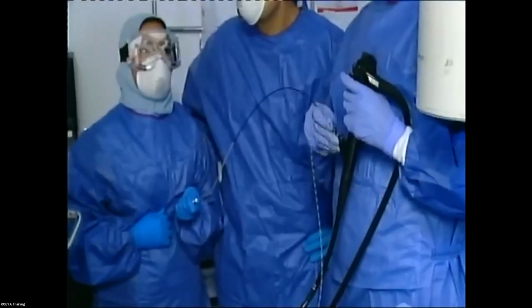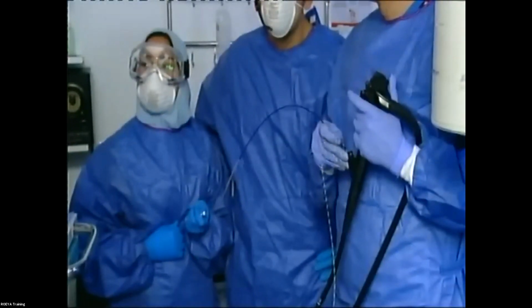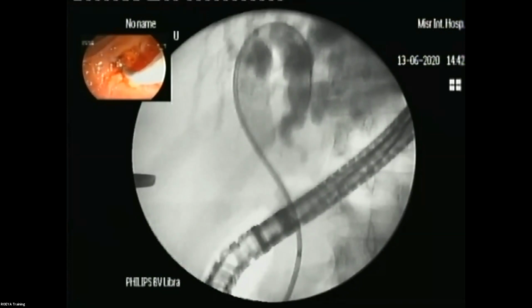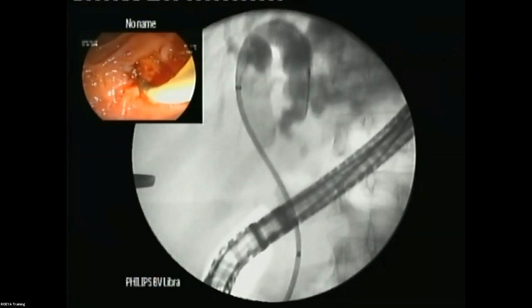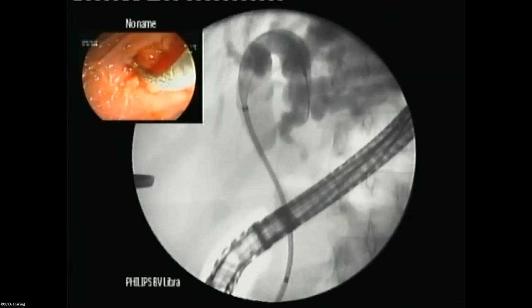Okay. So now it is very important that we are coordinated. We like to see the stent on the screen. And when I tell Salma to stop, she stops. Stop. As you can see, it went inside a little bit. So I'll pull it out again. Okay, Salma, go. X-ray down, please. Yes. So you can see the stent. Stop in position. Stop. It's not important up. You should look down. So this is a little bit of pressure from Dr.